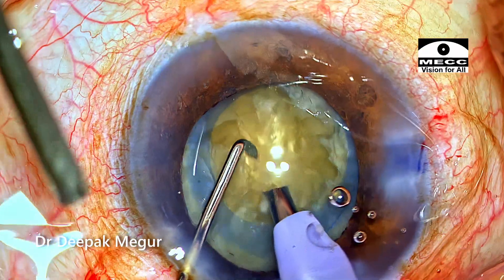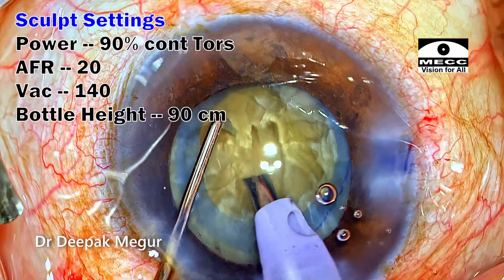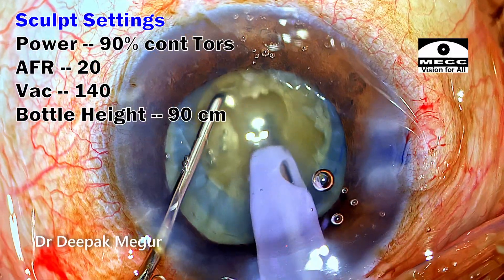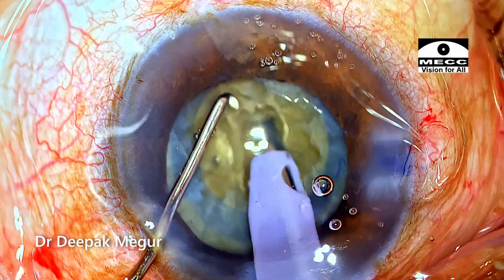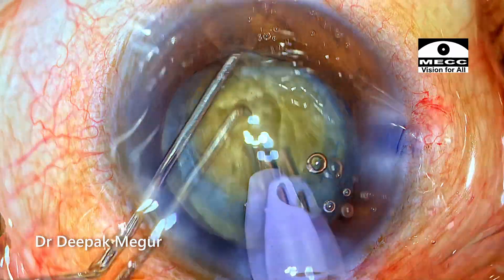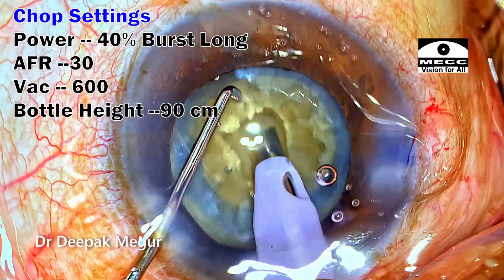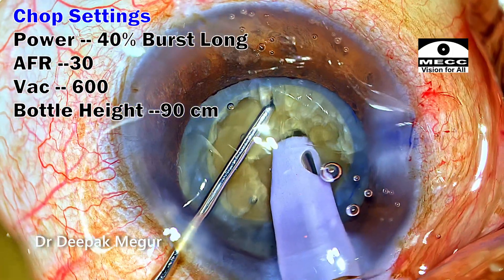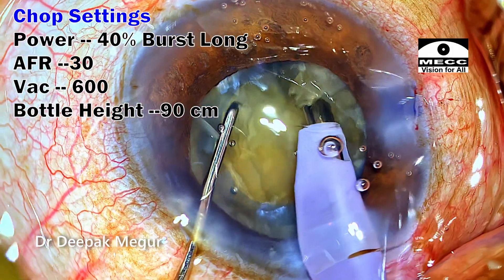The superficial epinucleus and cortex are aspirated. As is my strategy with denser nuclei, I begin by making a small central trench. Once I've reached 50% depth, I change the settings to chop mode. The phaco tip is buried and a vertical chop maneuver is done, which splits the nucleus in the distal half.